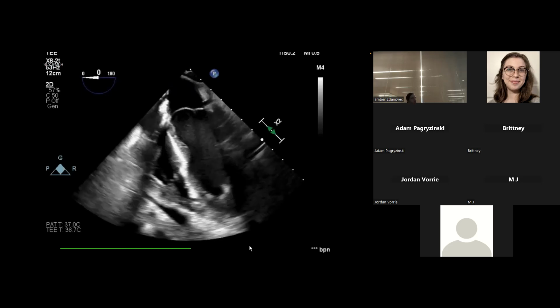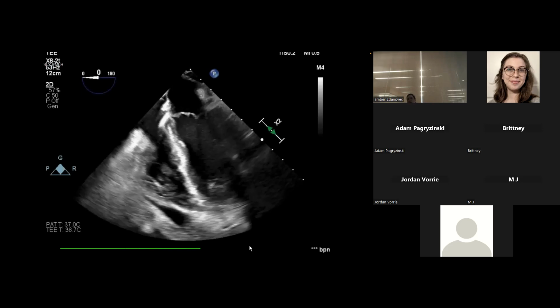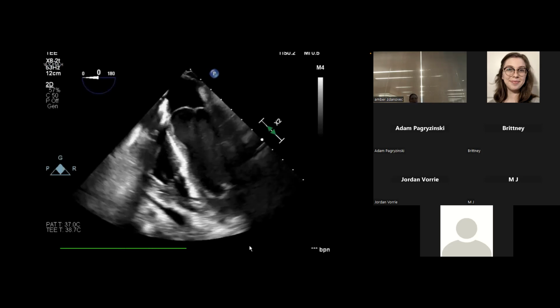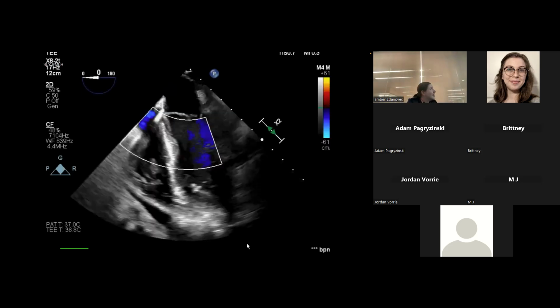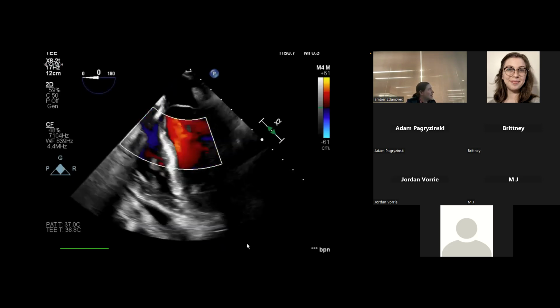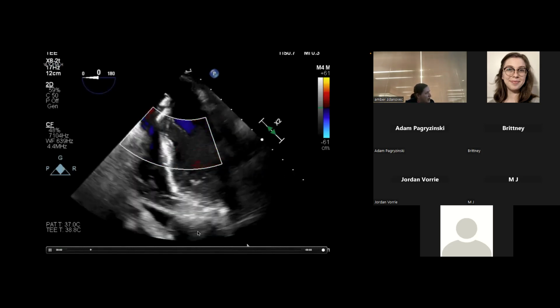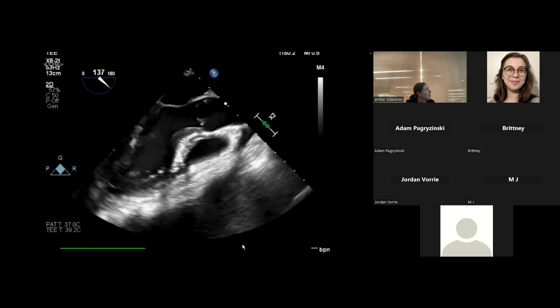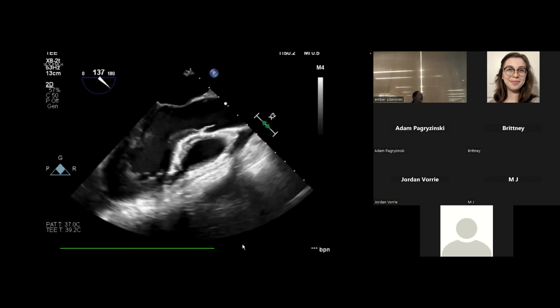Does this look normal or abnormal? Abnormal. How abnormal? Extremely. Okay, perfect. And that's what I said too. I go, what the hell am I looking at? So then we put some color on it. I don't know why I didn't get the mitral. I think this one was looking at tricuspid. But the right side looks completely smushed. And maybe there's some pericardial fluid. All right. So now we're going to go to long axis.